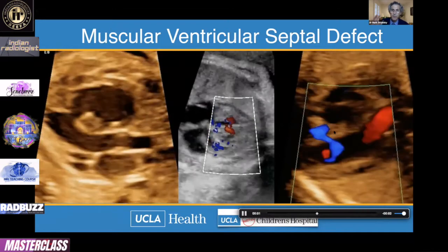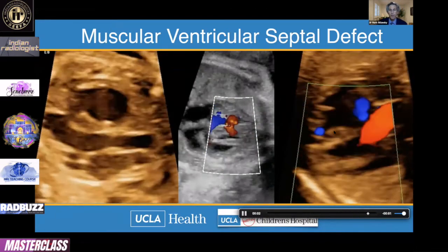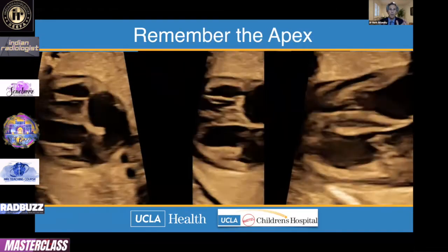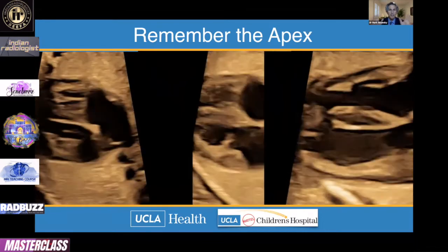Very easy to miss these or to overcall, and the key is to optimize. So many patients are referred in for possible VSD. But also, here's another tip: remember the apex. This is all the same patient. Believe it or not, this is the same patient.